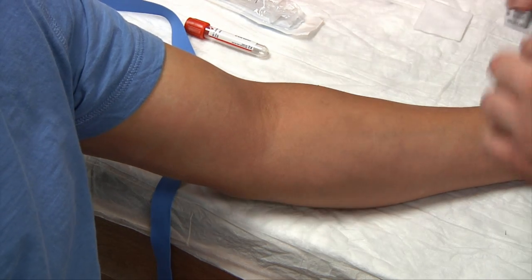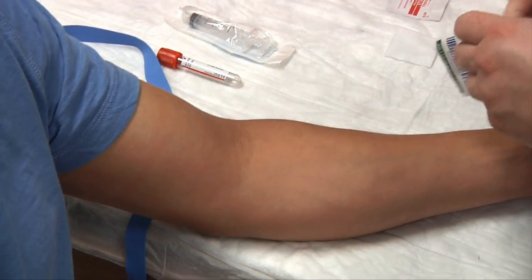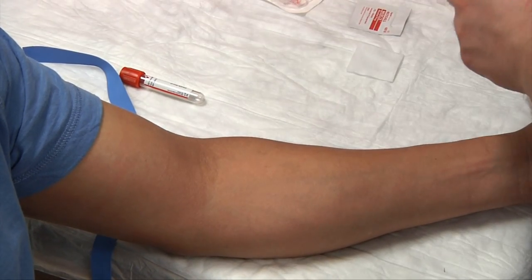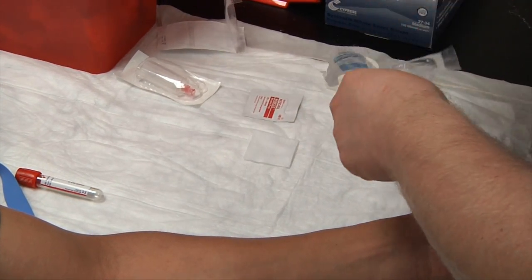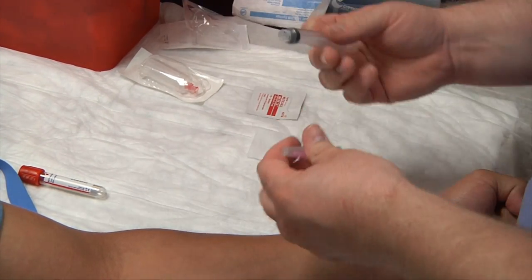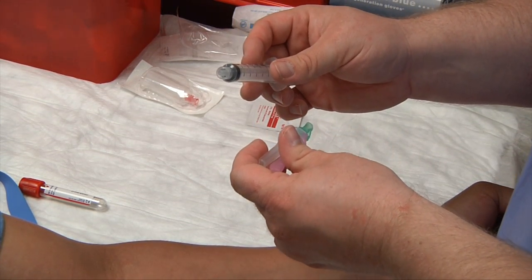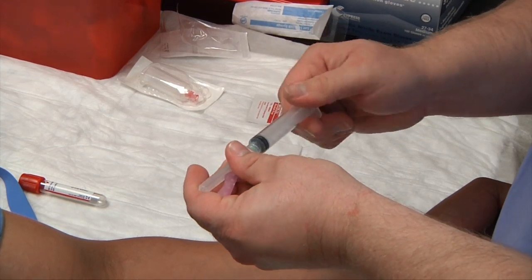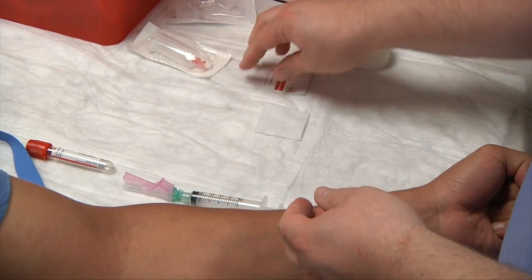Assemble our needles. Make sure that the needles and syringe are in date — if expired, the needle and syringe would no longer be sterile. With our syringe, there's a lure tip — lure means thread — so we thread this on like a screw until it's good and tight.